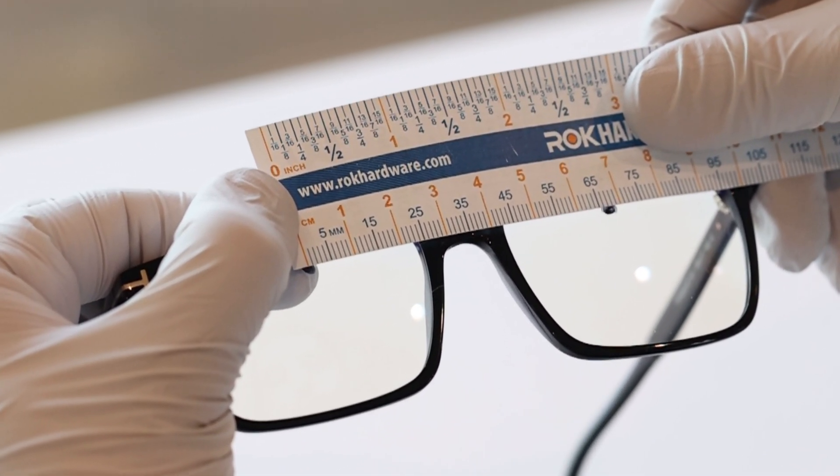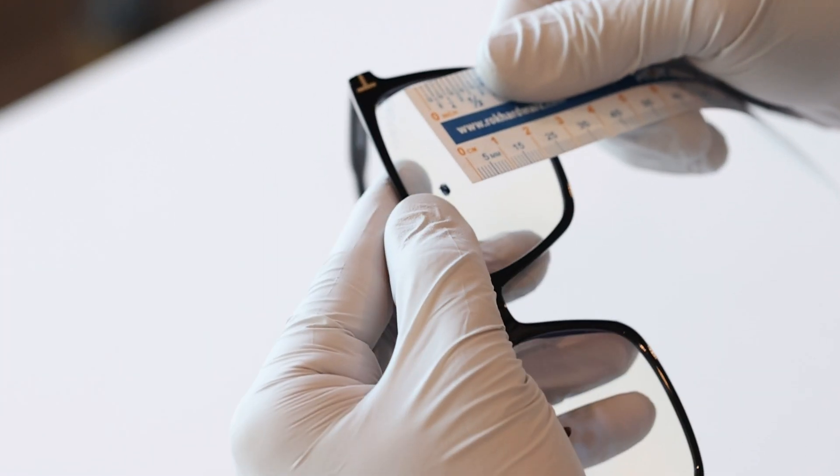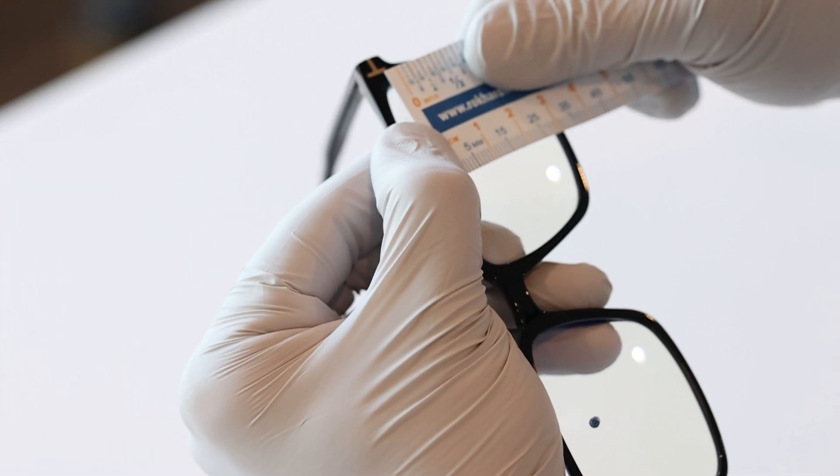You can also measure your fitting height. Measure from the deepest part on the bottom of the lens up to the dot on your lens. Do this for both your left and right lens.